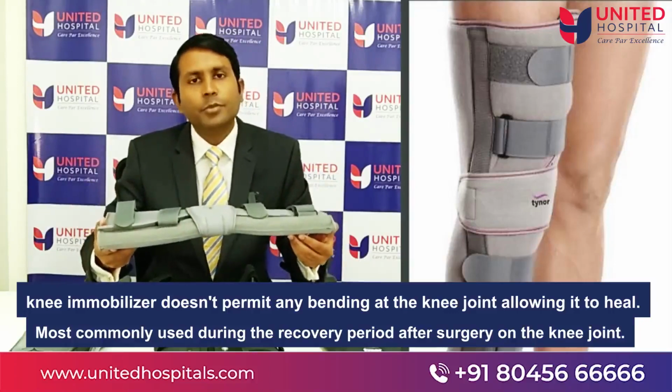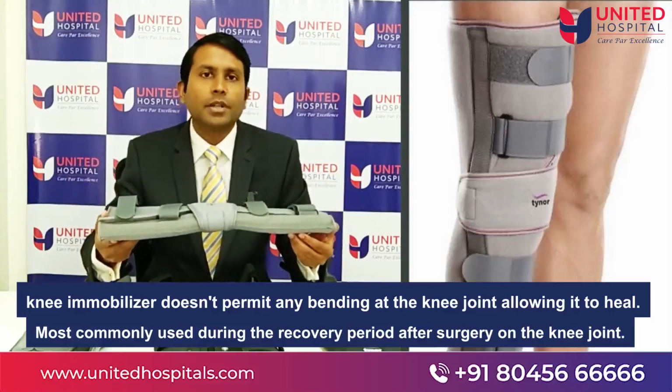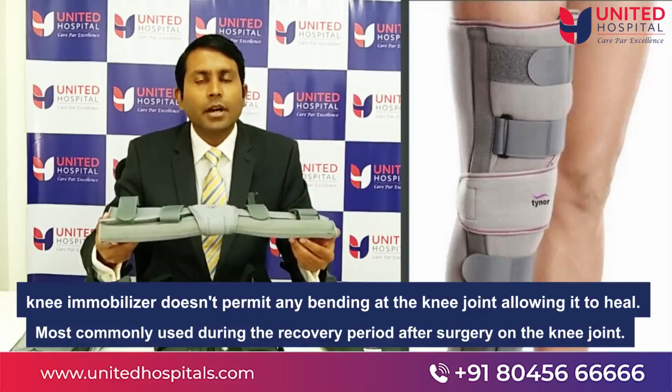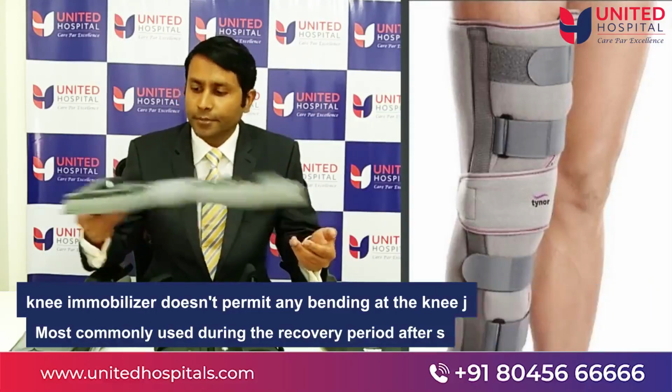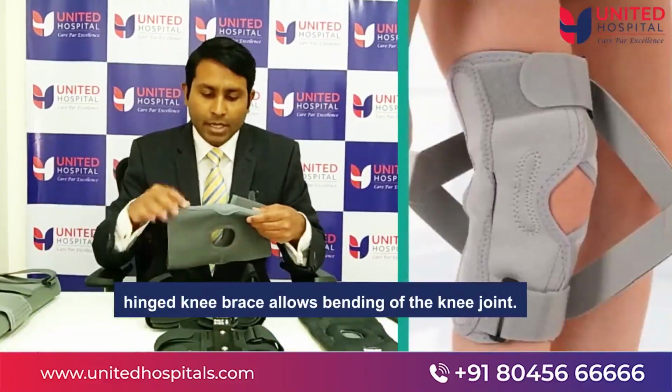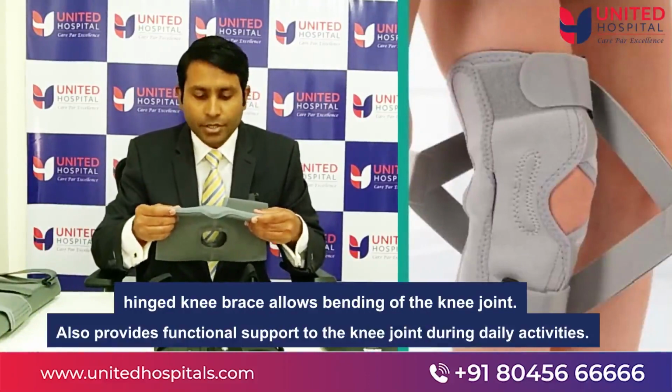And this lack of movement is used to our advantage because it allows the soft tissues and the structures of the knee joint to heal and recover, either following a ligament injury or after any recent surgery on the knee joint.